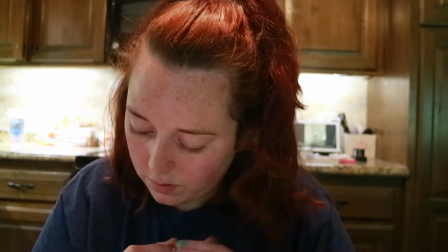The warm water increases circulation in your hands, which helps you get the blood easier. Remove the nail brush and start buffing your nail. Start scraping your nails. Scrape around the fingertip for 1 minute. Scrape underneath all nails for 1 minute and air dry. Okay. So, we're going to go wash our hands. Okay. They are dry. Well, air dry.